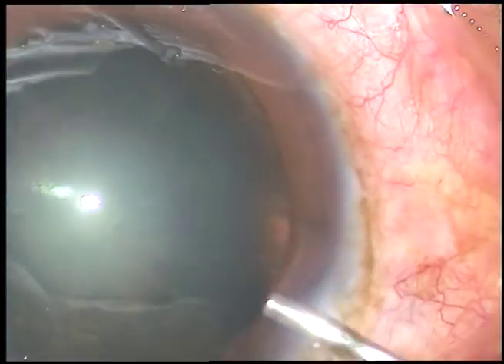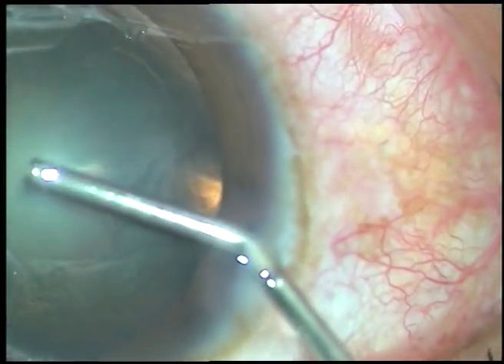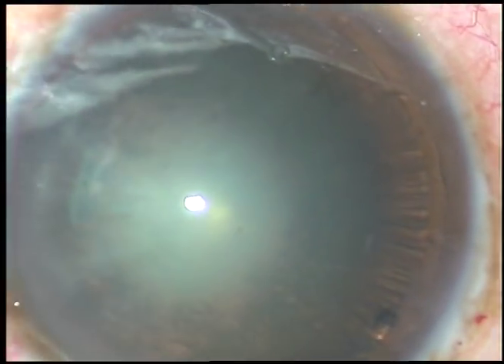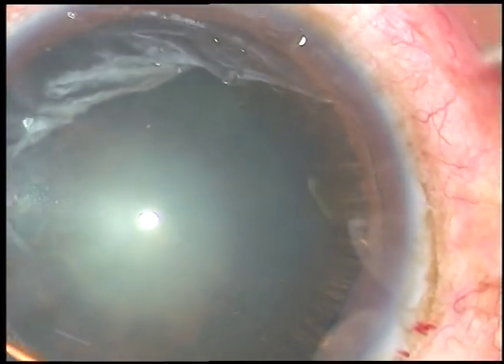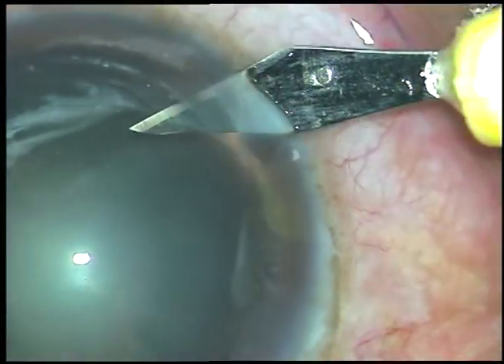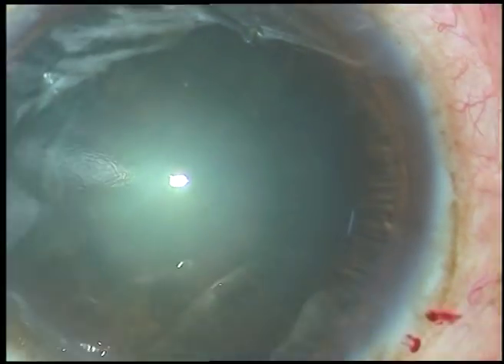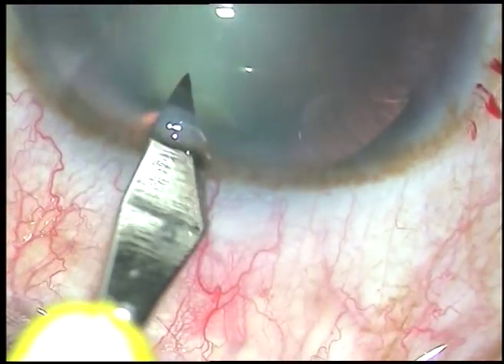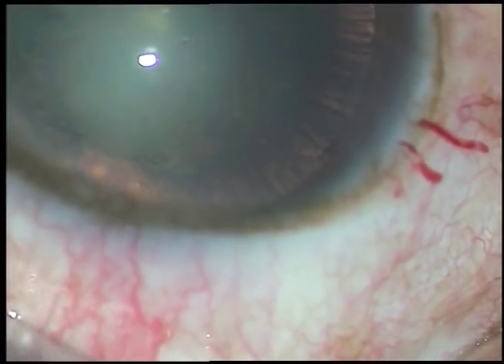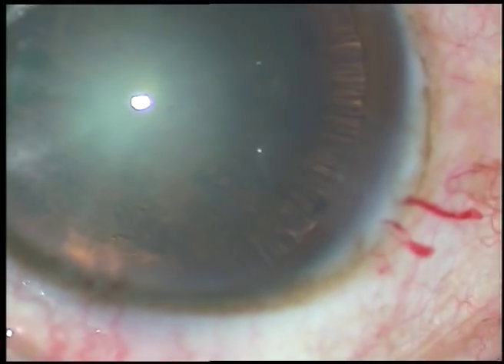Now viscoelastic substance is injected into the anterior chamber. Now I am making very small stab incisions — one stab incision at 7 o'clock and another stab incision at 12 o'clock.